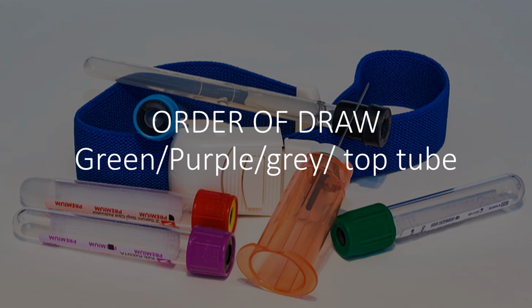Now with the green top tube, it has an anticoagulant in it. That's the additive in that tube. And remember, anything that's put in the tube is an additive, whether it is gel, whether it's silica, whether it's any of the multiple anticoagulants that are out there, whether it's some type of preservative or chemical, anything that is put into a tube is an additive.